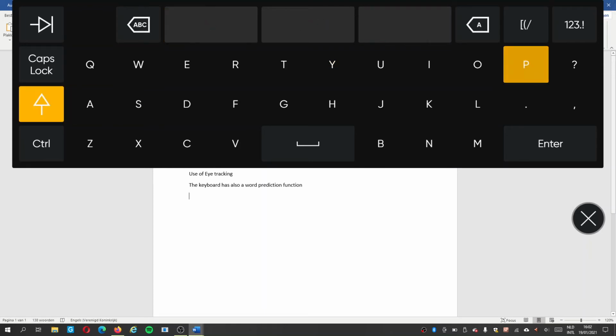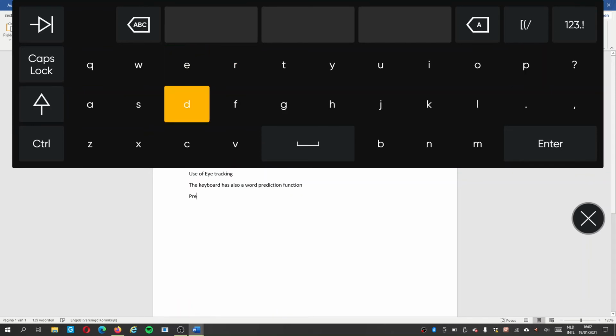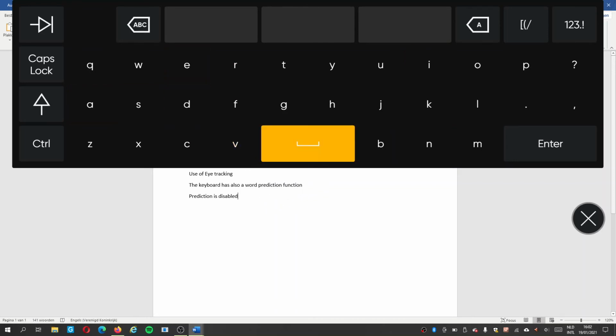I personally prefer to disable predictions, because I don't feel that I can type faster with predictions enabled. This is probably because I check too regularly if a particular word did show up, pulling me out of my rhythm of typing. Do any of you have the same feeling, or do you use predictions a lot?